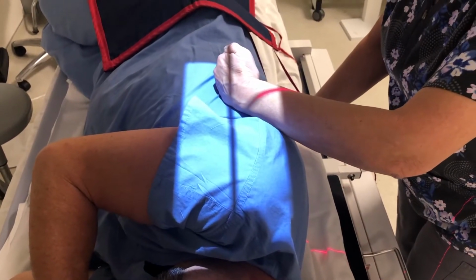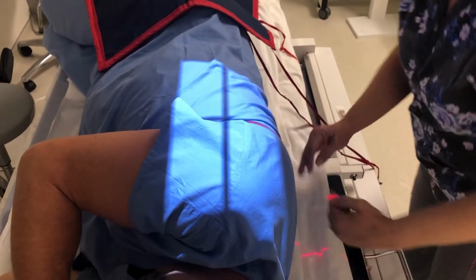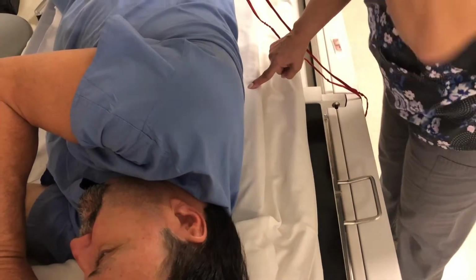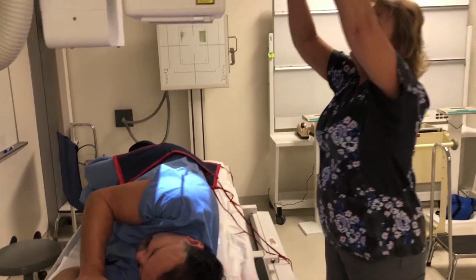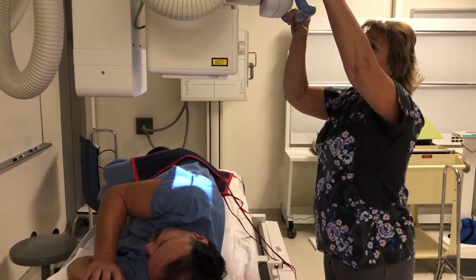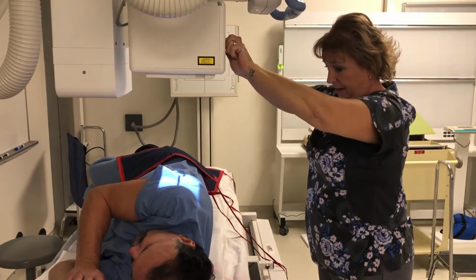So there should be a little bit of light left over on the edge here. You can see light. Why am I at 47? That's why it looked weird. Okay, I should be down at 40 for this. Okay.